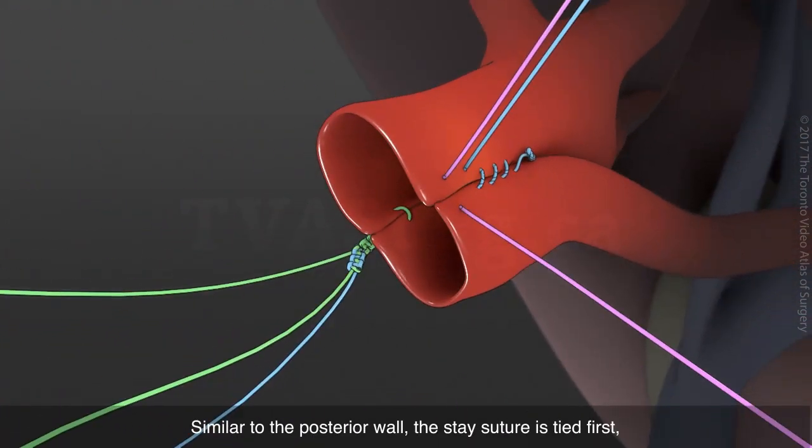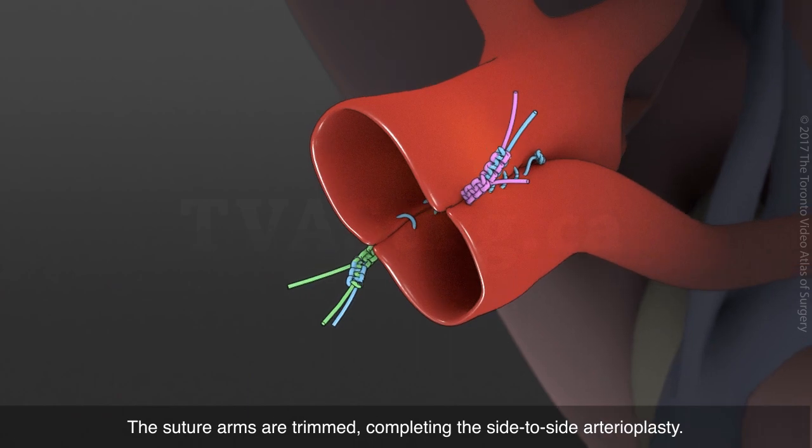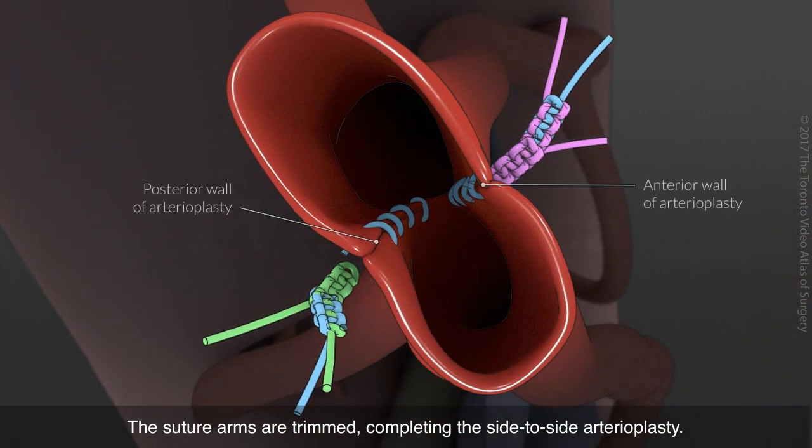Similar to the posterior wall, the stay suture is tied first, followed by the continuous suture arm. The suture arms are trimmed, completing the side-to-side arterioplasty.